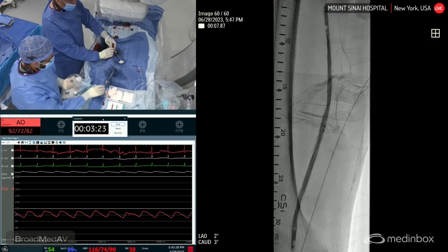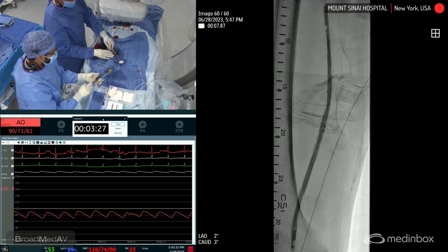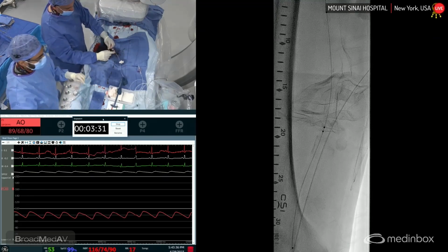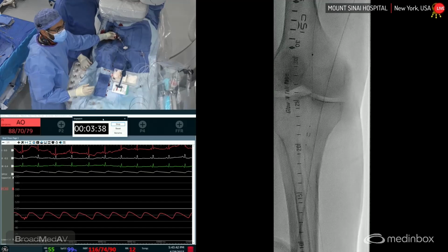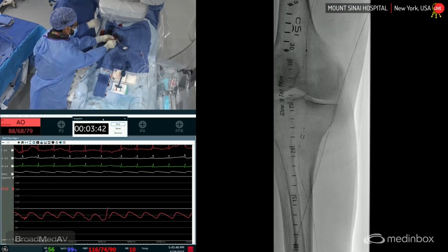With this large 035 Medtronic balloon, you really have to go down and make sure it's deflated before you do anything, and wait till the bubbles stop moving. What we tend to do is look distal before we pull it out, so our filter doesn't move. And we don't want the wire to come back.